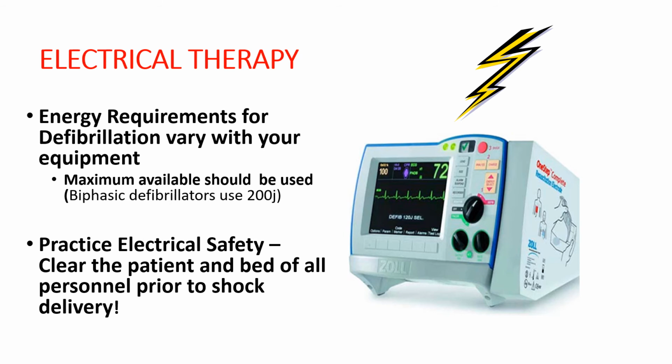When you have to defibrillate somebody, whether you're synchronized cardioverting or defibrillating, you always make sure that you clear the patient, the bed, and the personnel before you deliver that shock. You would visually and verbally clear the patient. You don't just press the button and say clear. You say clear, you look to make sure nobody's touching the patient, and then you press the button.